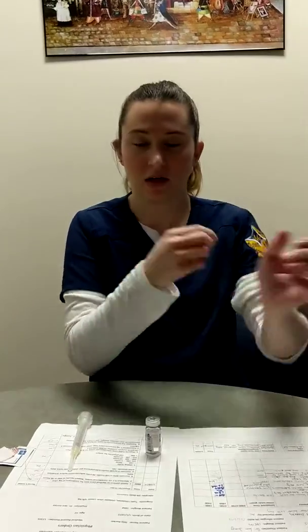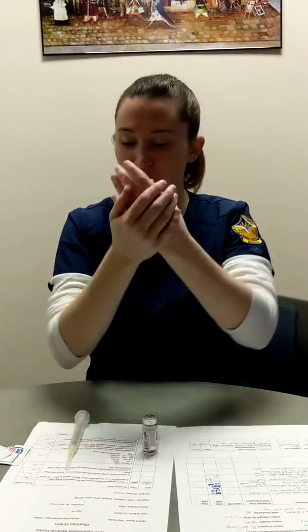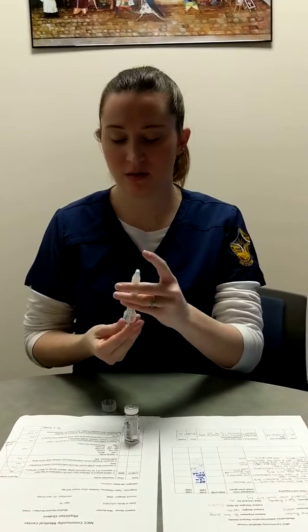We're going to have our TB syringe. We are going to wash our hands. And we're going to use a brand new alcohol swab, but we're using what we have. Clean off the top of our vial. Get our syringe ready.